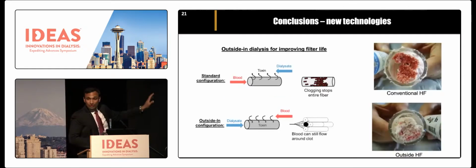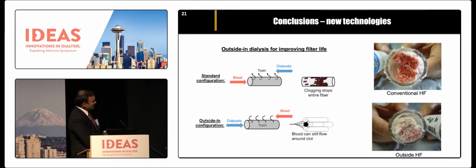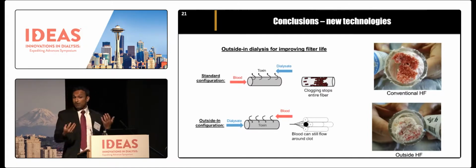And the last thing we want to talk about is this outside-in technology. Basically, if you change the blood and dialysate flow configurations, there is a possibility of extending filter life. We're now in the process of trying to come up with better engineering solutions so this can be commercialized.